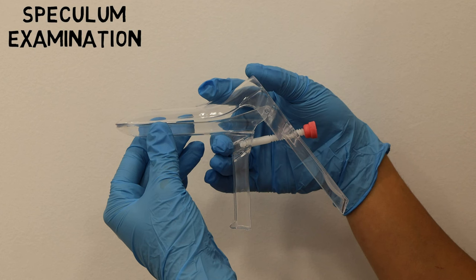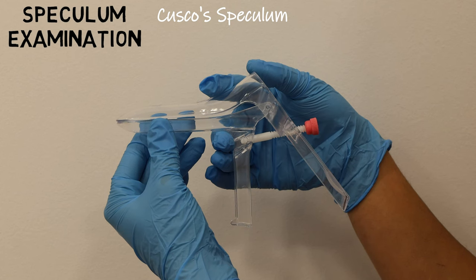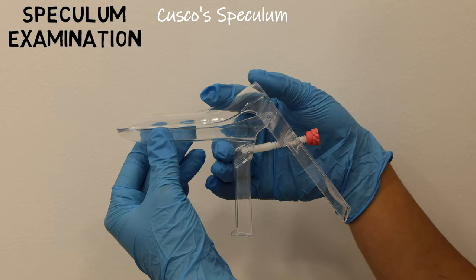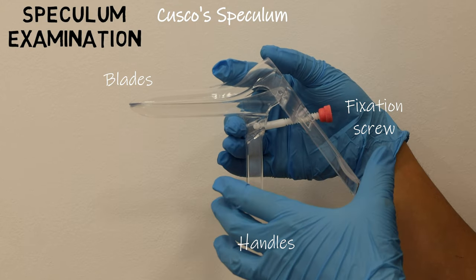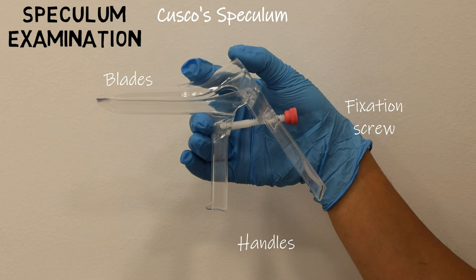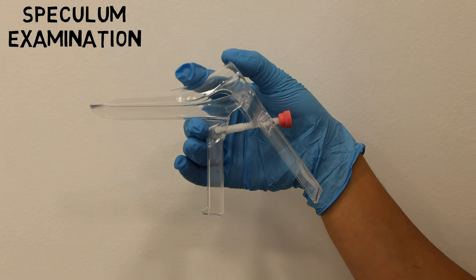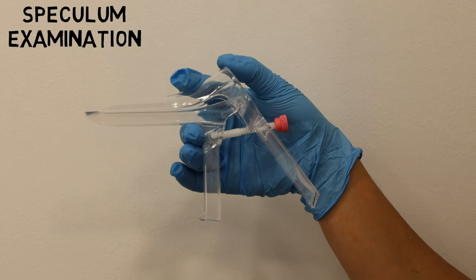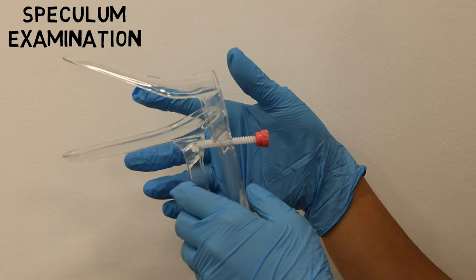Next up we have the speculum examination. This is a Cusco's speculum — here we have the blades, the fixation screw, and the handles. I like to hold the speculum with my thumb and index finger above the anterior blade and my third finger below the posterior blade. This gives me good stability and prevents the blades from opening before I want them to.